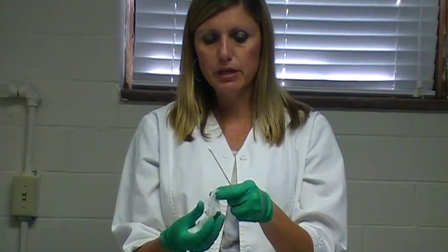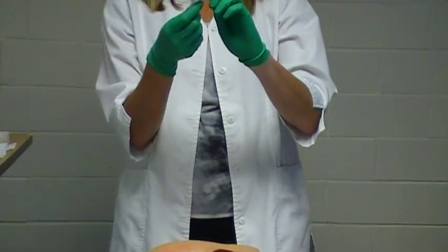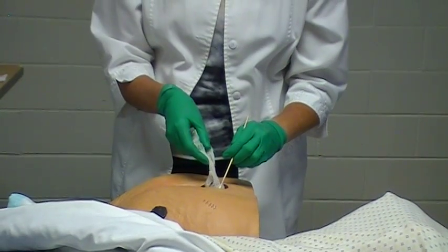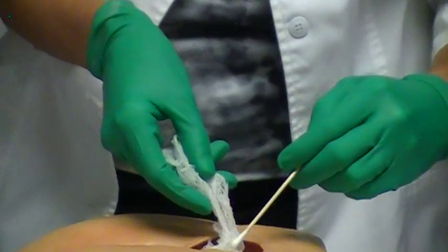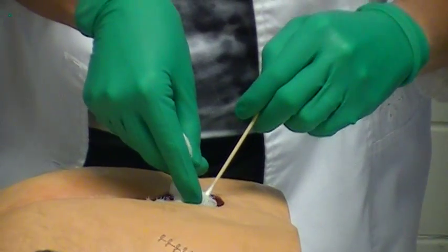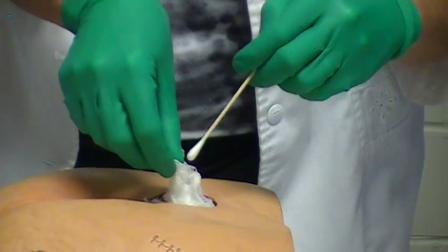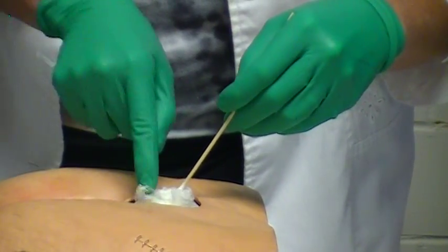Now, I picked up my Q-tip. It's sterile because it was still sterile in that packaging. And I'm going to try to just hook some of that gauze around the end of the Q-tip. What I'm going to do is start loosely packing without exposing any of my gauze to the outside of my wound. Now, this sometimes takes a while to do. The big thing is you want to try to keep sterile to sterile, without touching any of the outside of the wound.